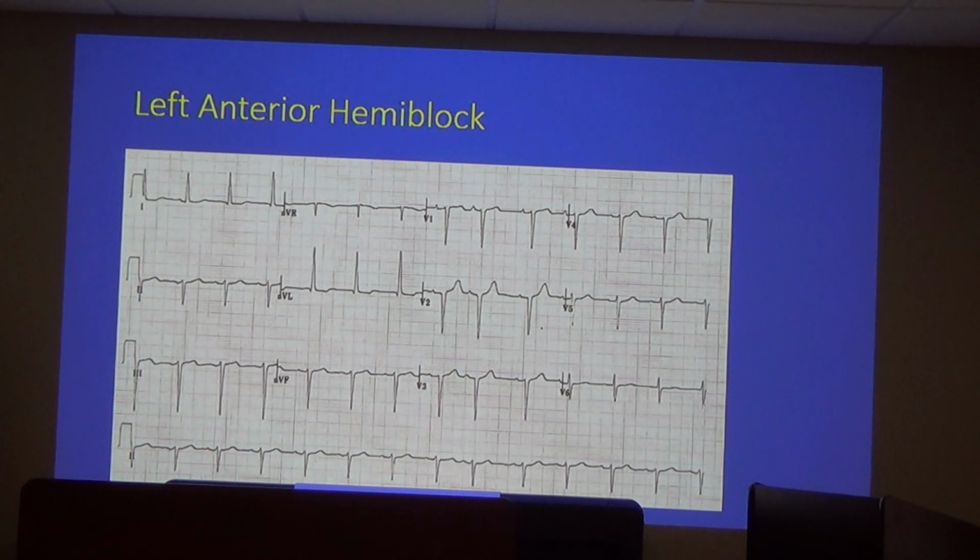Interestingly, lead 2 is the one that was on this side. If it's negative in lead 2, then it's actually more negative than negative 45, because it's far up in that way. Lead 3 could still be normal, but anyway, that's the interesting thing. If leads 2, 3, and AVF are all negative, and 1 and AVL are positive, you know it's going upward and to the left. And that's a left anterior hemiblock.